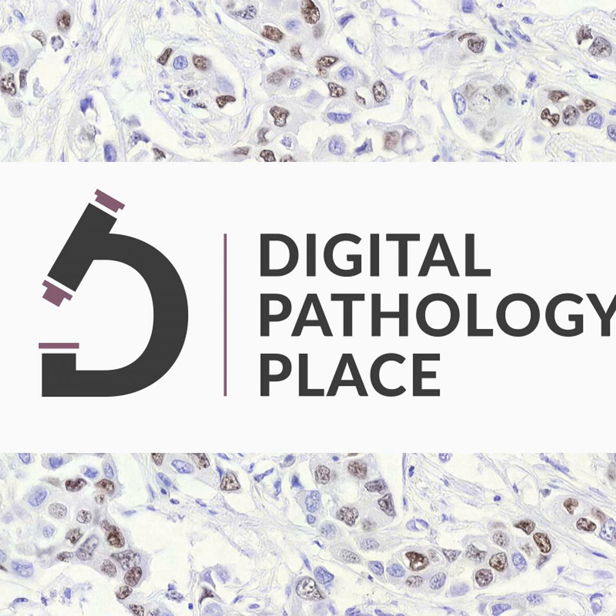So there's a lot of analogy, and the same technical problems: damn large images that don't fit in any computer memory, or really few memories can handle those. So similar, and you cannot see the data in one glance. You need to zoom in, and so technically the pathology tech side is the same as satellite imaging.